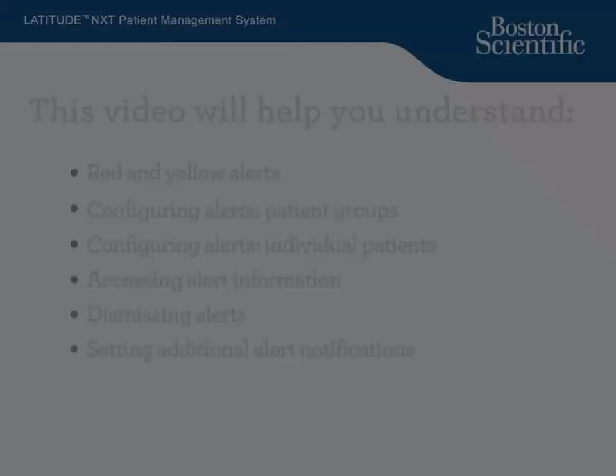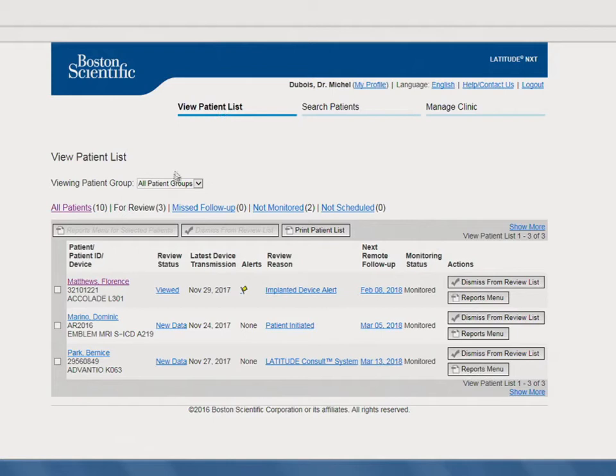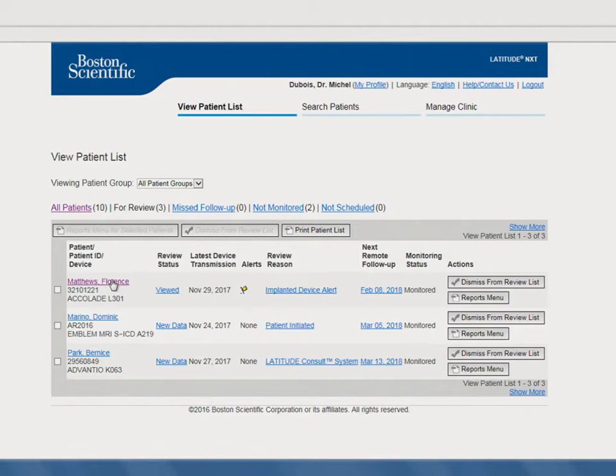Next, we'll show you how to dismiss alerts. There are two ways to dismiss alerts. The first option is found on the View Patient List. Simply locate the patient and click on the Dismiss from Review List button. If you would like to dismiss multiple patients, simply click the box to the left of each patient's name and click on the Dismiss from Review List button. The second option is found on the Individual Patient page, which is particularly helpful when you're reviewing one specific patient's data. From that Individual Patient's page, simply click on the Dismiss from Review List button.